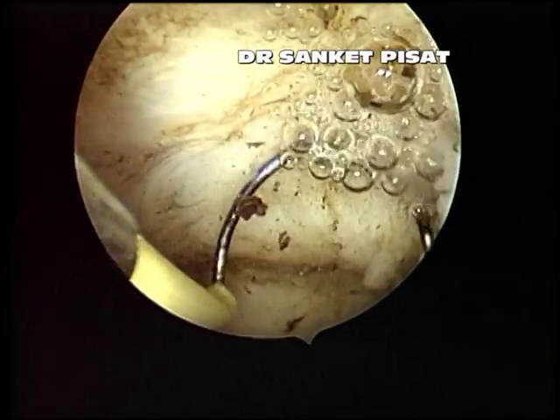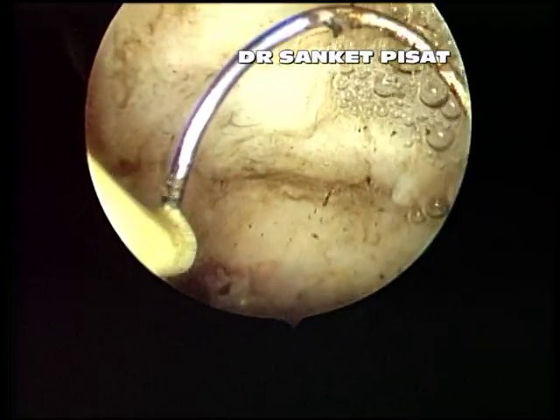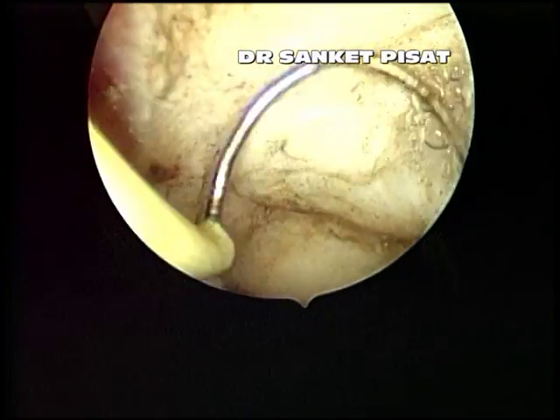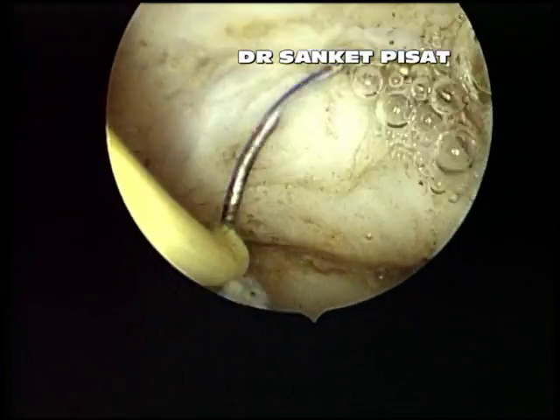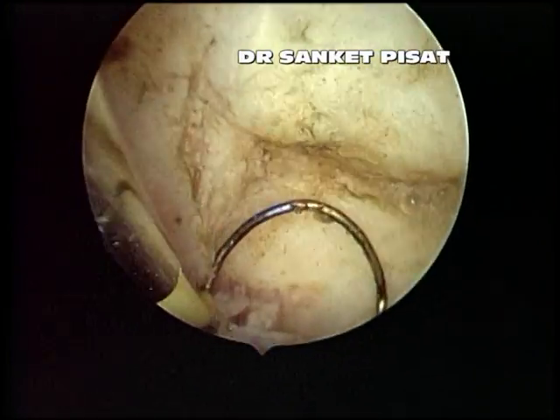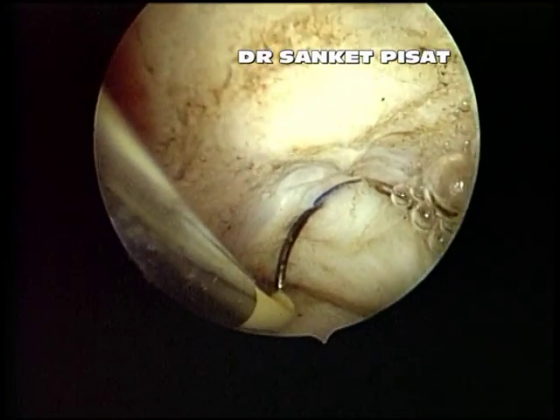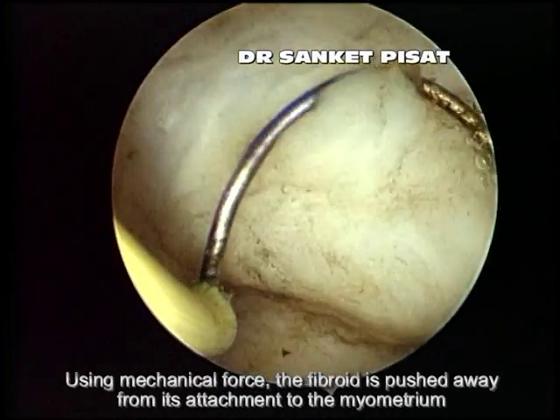Next, using a cold loop dissection technique, an attempt is made to push the fibroid away from its attachment to the normal myometrium. This displacement is sometimes anteriorly and sometimes posteriorly towards the surgeon in a gradual effort to shift the fibroid away from its normal attachment and into the endometrial cavity.